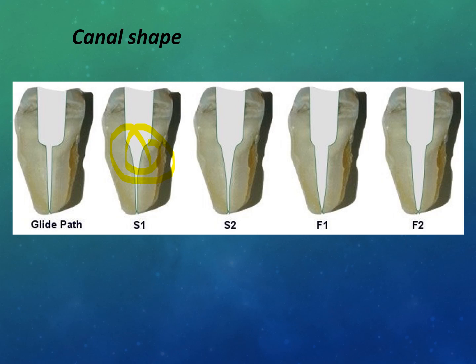And S2, your middle portion is increased. As we mentioned, S1, S2, middle portion, this is the middle third. F1 is your apical third. This one is apical. So this progressive taper is always helpful for the files to reduce the fatigue, as I mentioned before also. So this is the idea behind your ProTaper system.